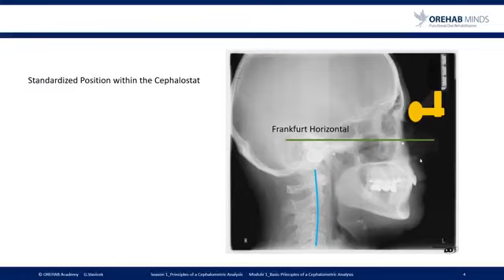In addition, we need a calibrator here, so we have the possibility to recalculate the magnification factor.